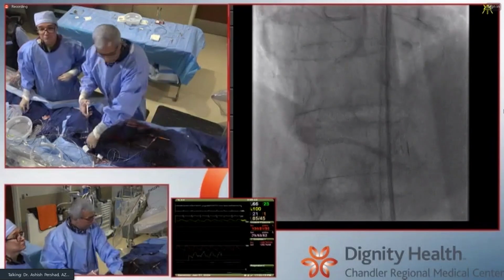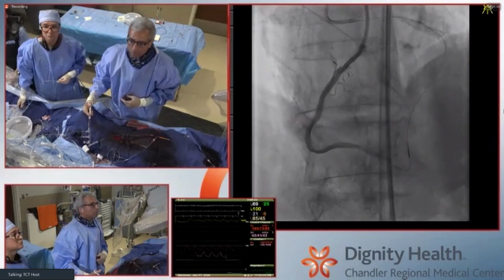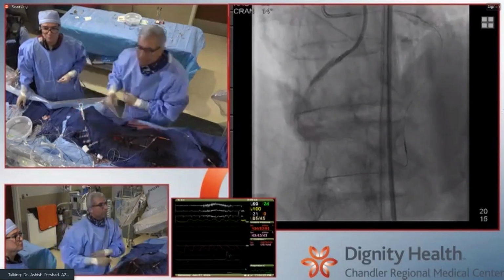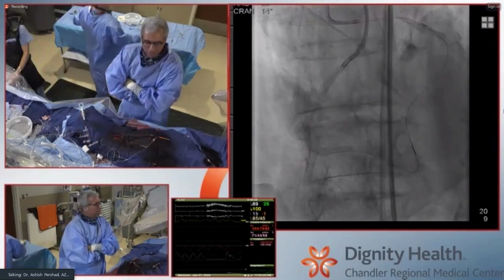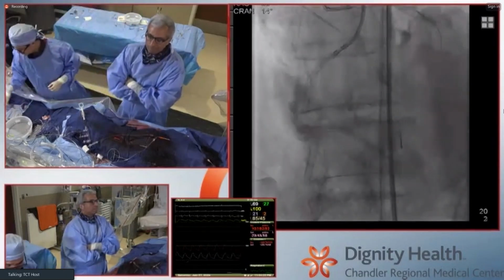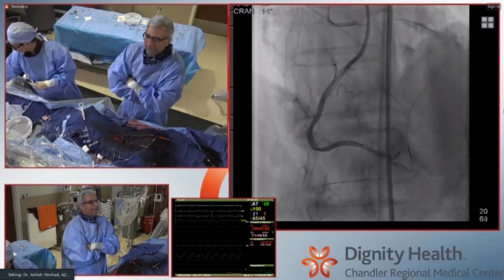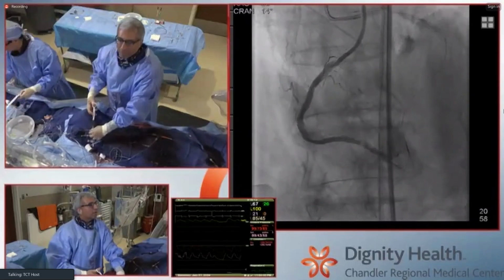You have to stent a bit more distally. Little dissection distally, yeah. But flow is good. I think we're fine. I think the issue was that your antegrade wire probably was subintimal, and it roughed up the distal vessel. So you're just going to have to stent past that.